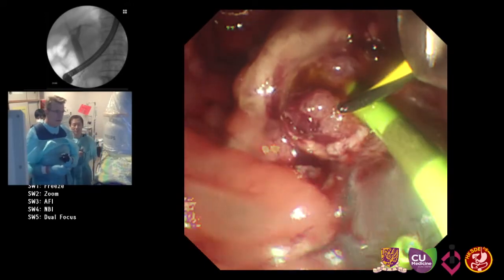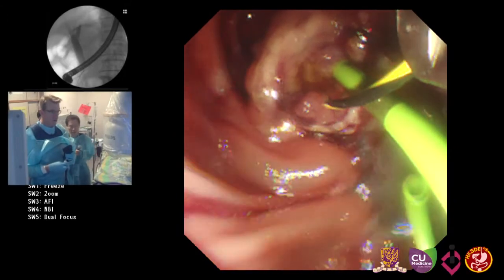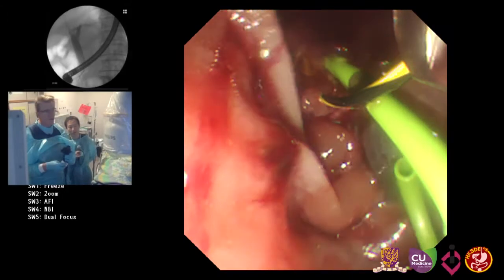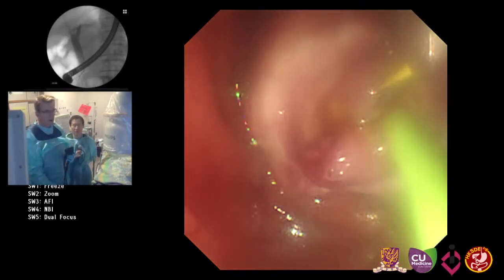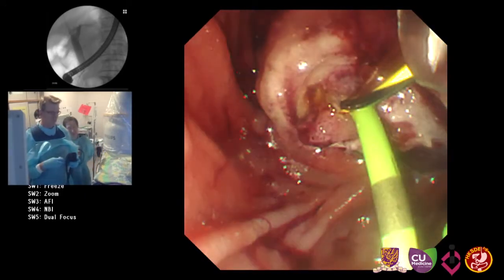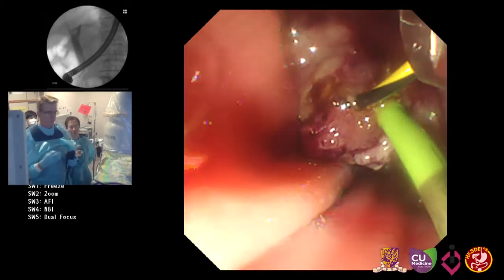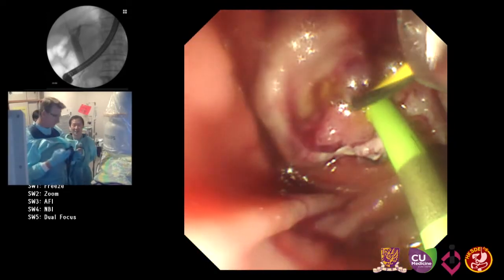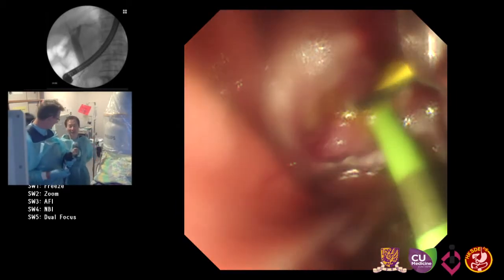And then the other advantage with these extensive resections is it causes an outward compression of the papillary mechanism, and most of the bleeding arises from around the papilla. So we find now with this approach that it's infrequent that we have major bleeding after a complex resection like this, or even much more extensive. So I think it's a really good innovation, particularly if you've performed an aggressive papillectomy, because it connects the bile duct to the duodenum if you're worried that the two have come apart.